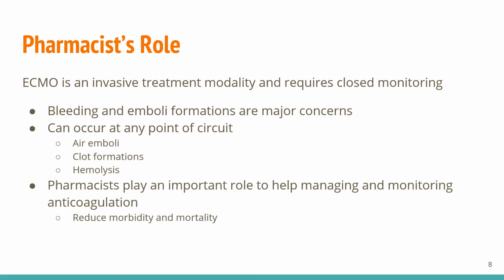Pharmacists can play an important role in ECMO since it is an invasive procedure for which close monitoring is required. Bleeding and emboli formation are the major concerns because the circuitry leaves a large foreign surface area that can allow a massive inflammatory response to occur, which can lead to air emboli, clot formation, or hemolysis. Thus, we can play a role in helping manage and monitor anticoagulation to reduce morbidity and mortality in pediatric patients.